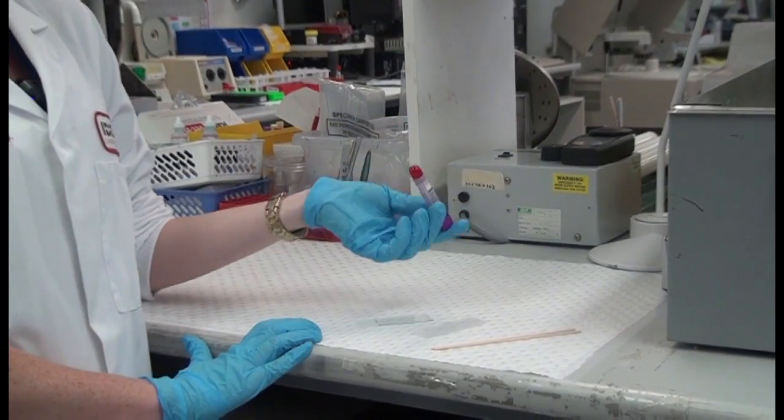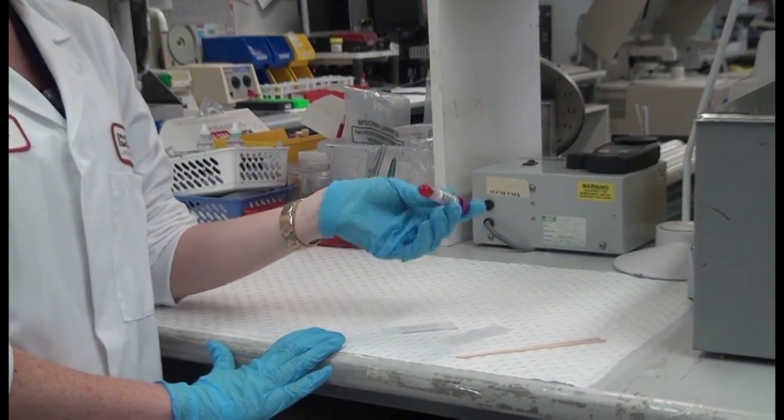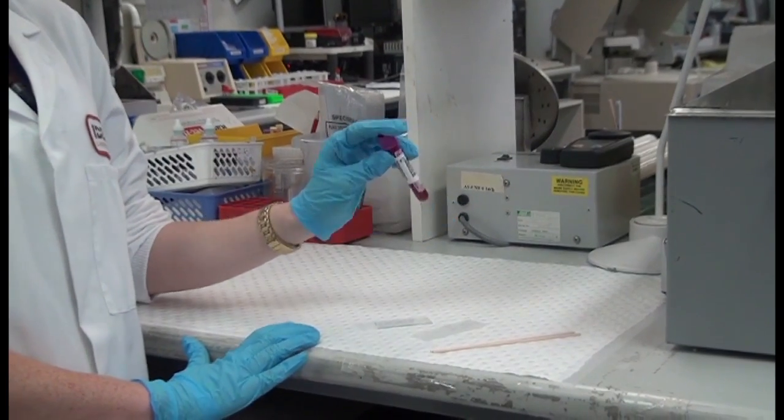I'm going to start by making the blood nice and homogenous by inversion, about five times. Not too fast if you want to avoid making any bubbles.